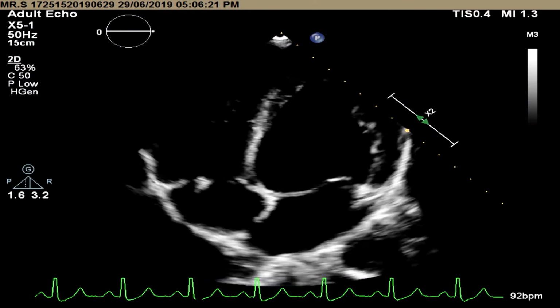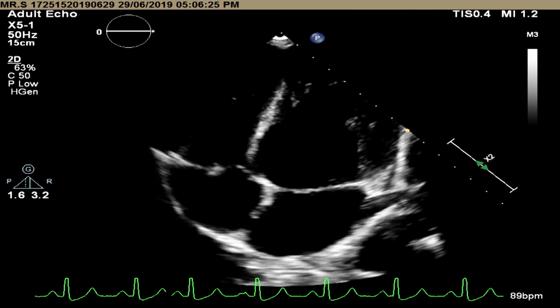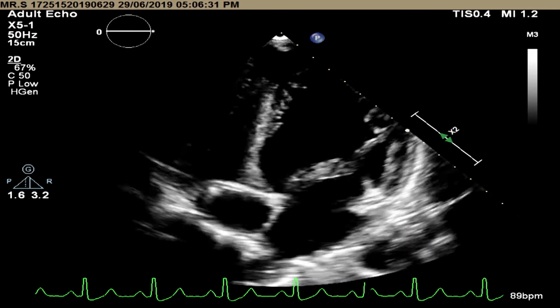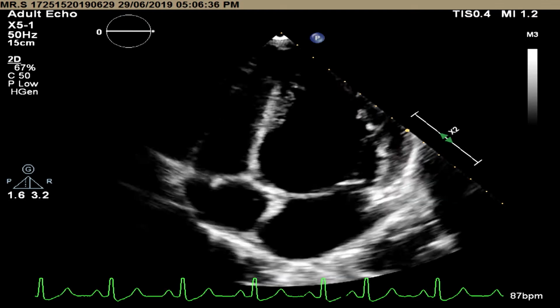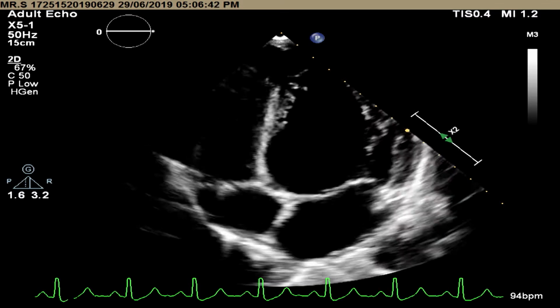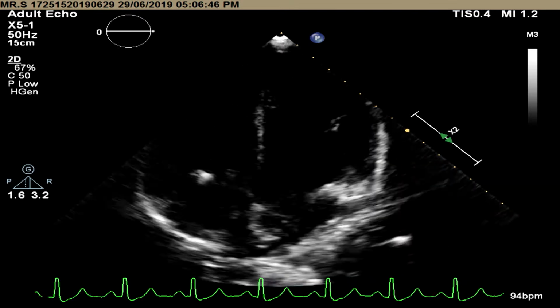Yes, you are able to see that there is some degree of LV dysfunction. However, the systolic blood pressure is also quite high. So we will try to trim it down a little bit with pharmacological agents. He's looking comfortable. You're okay? So you can appreciate the acute afterload mismatch with left ventricular dysfunction. Show a little better LV apical view. Show the entire LV, all the segments.